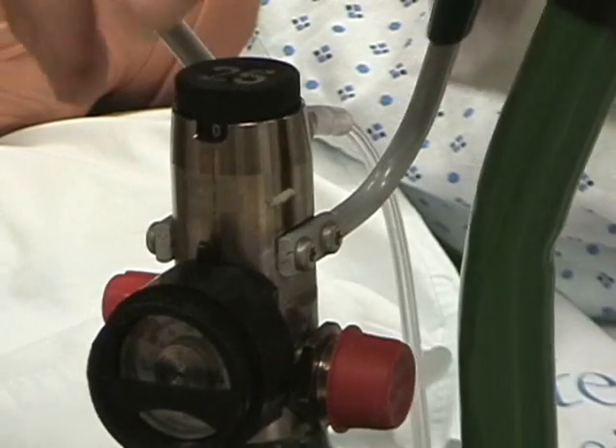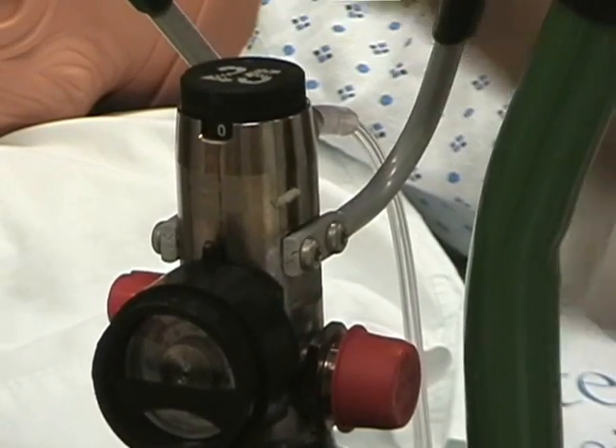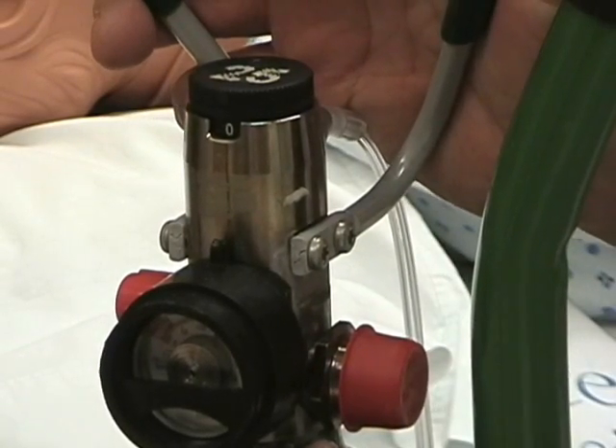When this tank is at the refill level, you simply remove the tank and get another one exactly like this that's full.